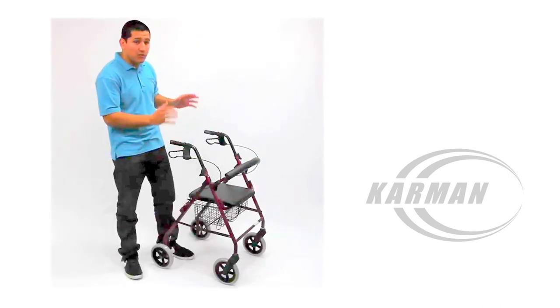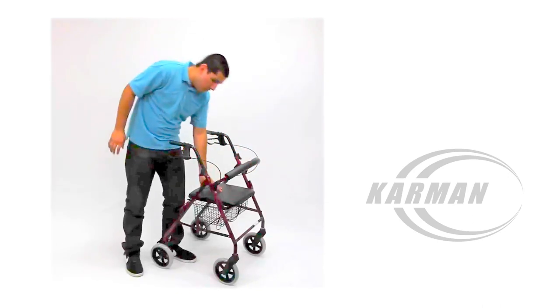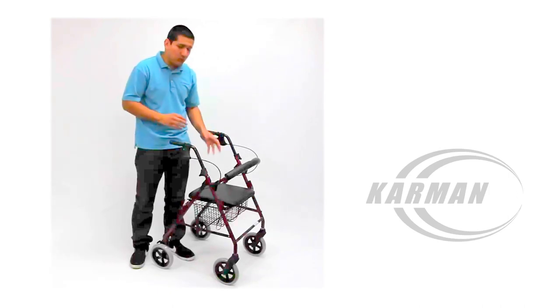This Rollator comes standard with the usual, which would be the padded backrest, padded vinyl seat, and your wire basket, which all of course is removable.